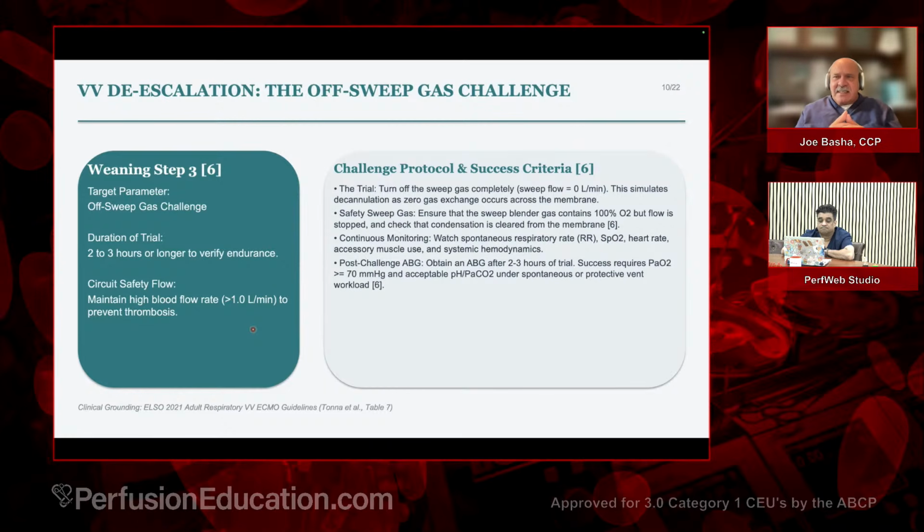Now, some places say you have to clamp it. Some people say you have to disconnect it. I've heard all kinds of things. You don't have to do any of those things. You have to turn the sweep off. That's all you have to do. If you do those other things, that's fine if you want to. I don't care. You want to disconnect it, that's your business. Go ahead.